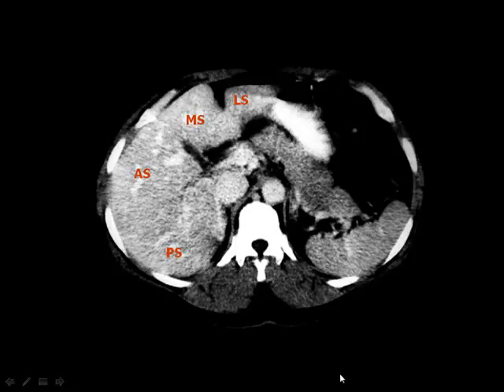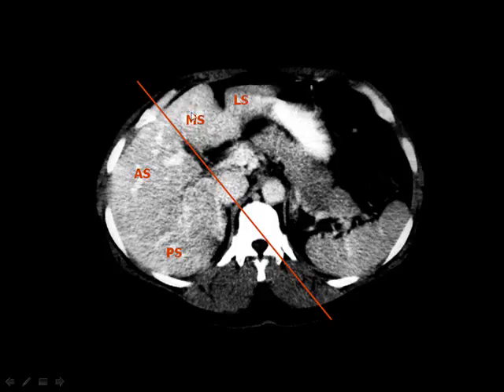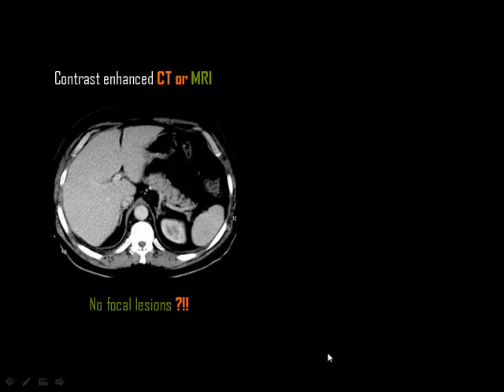The liver has two lobes — left and right — separated by a line connecting the inferior vena cava to the gallbladder. The left lobe is further divided into two segments by the fissure for ligamentum teres: the lateral segment (away from the liver hilum) and the medial segment (near the rest of the liver). The right lobe is divided by a transverse line from the inferior vena cava into the anterior and posterior segments. You can also see the pancreatic tail, body, spleen, stomach, and diaphragmatic crura on both sides.